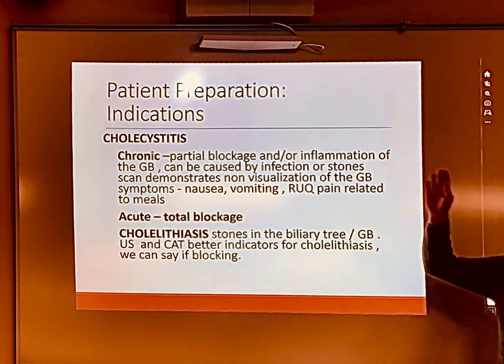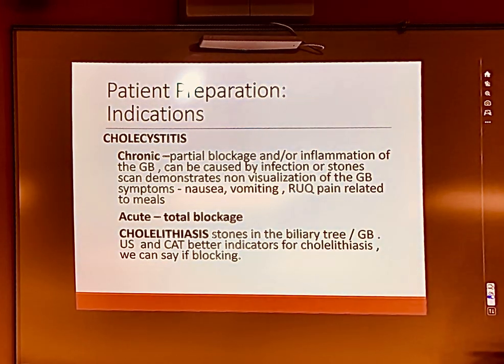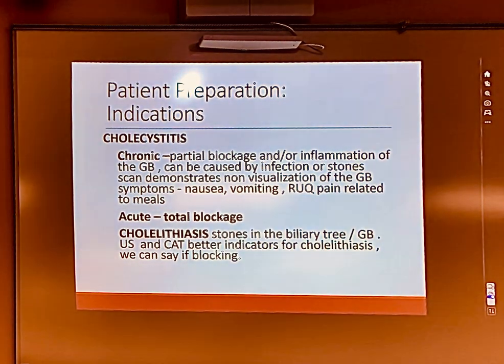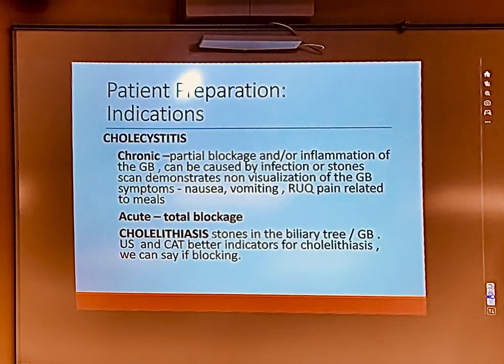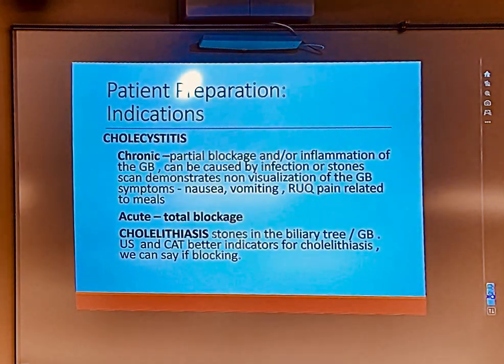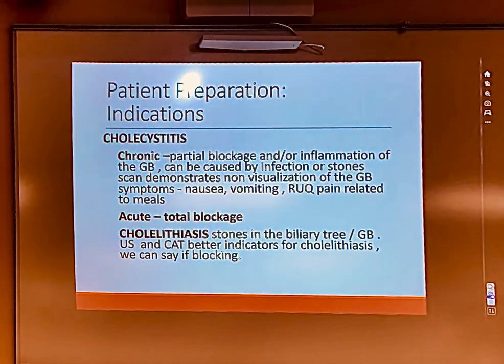And depending on what shows up in the biliary tree, you can tell them where the stone is lodged. If it's lodged in the cystic duct, your gallbladder is not going to show up. Or your gallbladder is going to show up and nothing else will show up, because it can get in, but now the patient's moved, sneezed, lifted their leg, whatever, moved it over to completely obstruct that cystic duct, and now it won't come out.